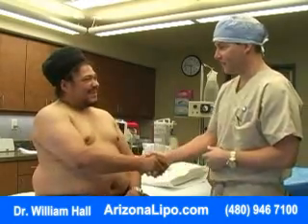Sure. Okay? Sounds good. Okay, so what we're going to do first is we're going to stand you up. We've already taken some photos. I'm going to draw on you and sketch out exactly what we're going to do, and then we'll put in the anesthesia and we'll remove the fat. Sounds good. All right. Thank you very much.